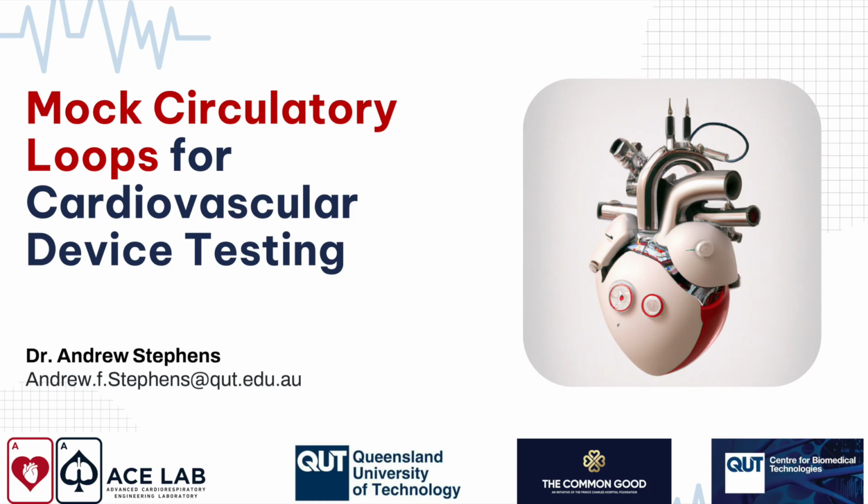Some of the things you should consider when you're picking one of these is, of course, price, but also things like how much electrical resolution do I need from my sensors?